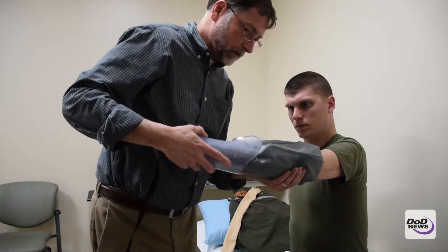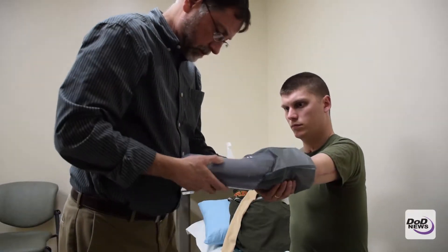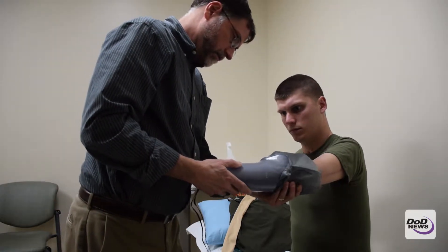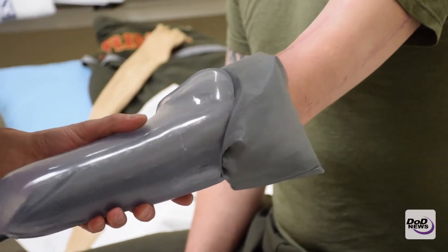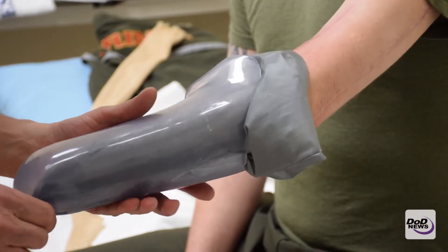If we need to make some changes, we can heat up this plastic socket and make it comfortable for them. Once we have achieved that, we go ahead and proceed to adding the componentry to the prosthesis.